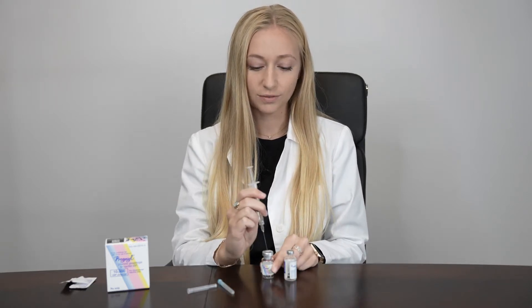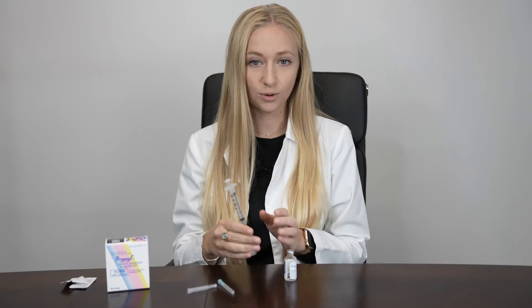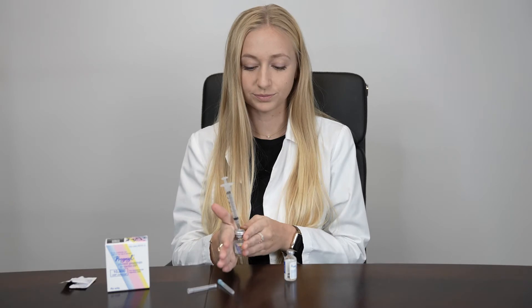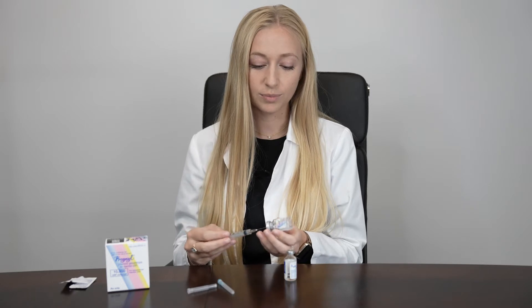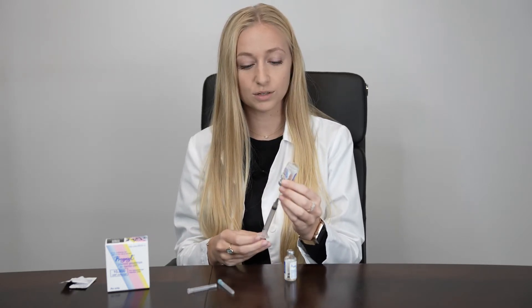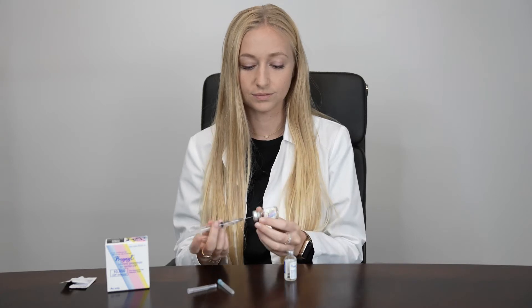Slowly inject this 1 ml of liquid into your vial of powder. You can gently roll the vial in between your hands to mix all of the liquid in with the powder. Once all of your medication has totally dissolved within the liquid, flip your vial upside down, ensuring that the tip of your needle is submerged in the liquid, and pull everything out. You should have an empty vial.